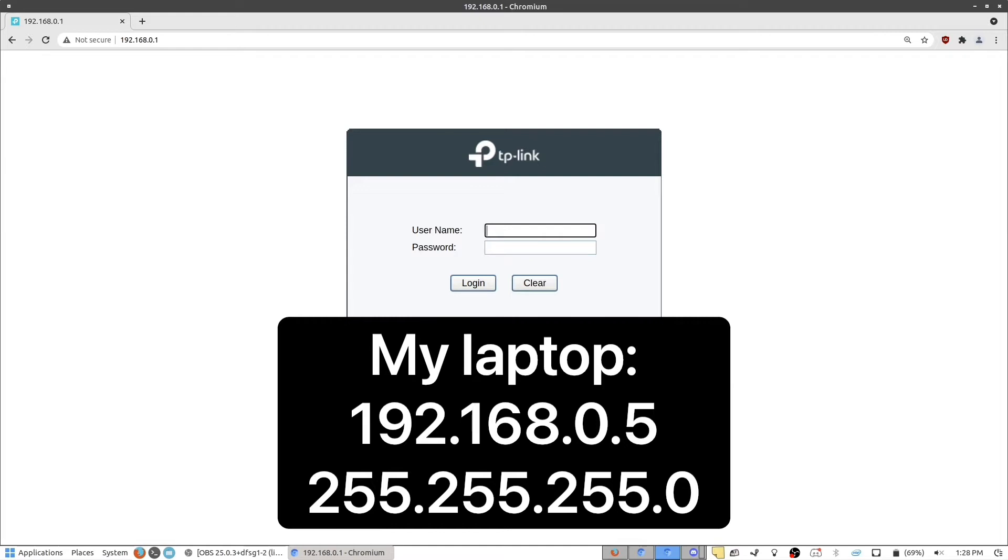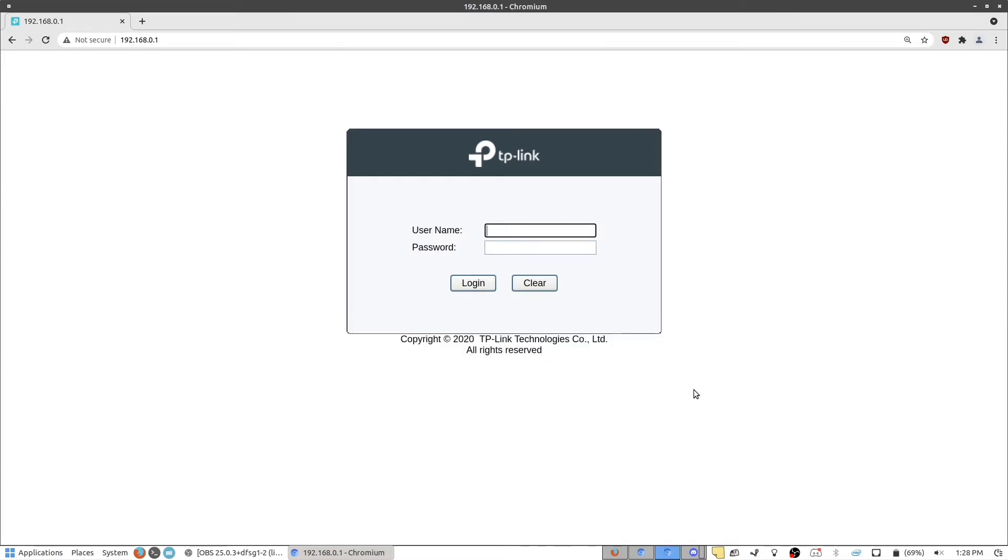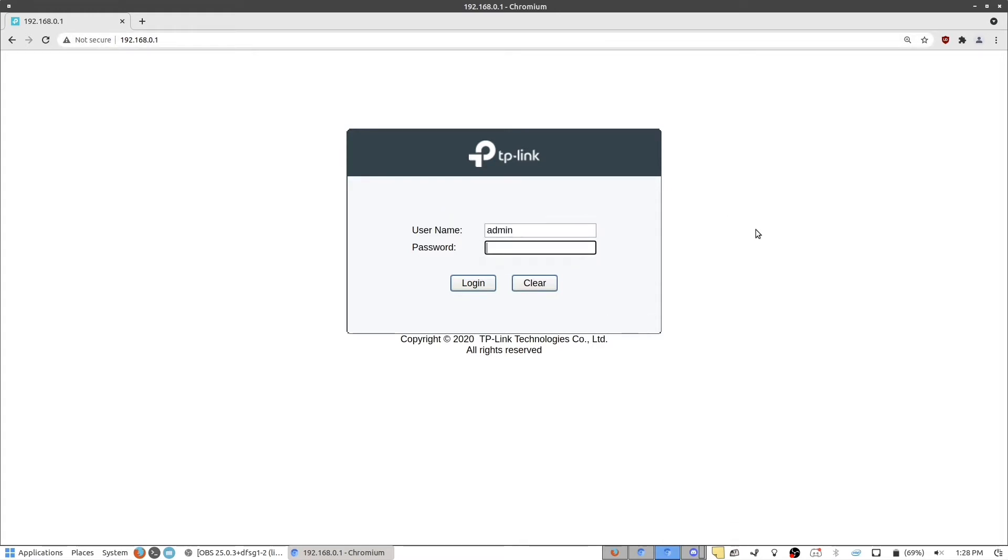So once you have that set up, you want to open your web browser and go to 192.168.0.1 in the address bar. And from there, you want to log in to the switch. In this case, the username and password is admin and password.